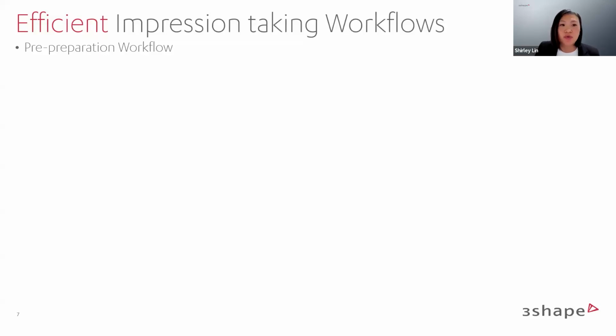Another reason why pre-preparation workflow is also great is because it allows you to have a file of the patient before you've done any prep, and with that same file, you can send that to the lab. They have a record of what it looked like pre-prep. What the software normally does with all scanners is it uses that same file that you've taken pre-prep, it copies that over, and then all you do is just fill it in with the preparation.